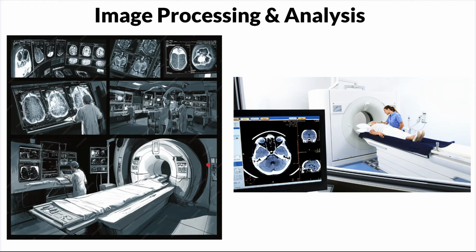Once you take the scan and you give it to the radiologist or neurologist for them to read, if the scan that you took is not all that clear, remember they are going to struggle to interpret the results. And yesterday we learned that machine learning and deep learning are able to extract certain features that we human beings will find difficult to see. But although they are able to do that, we still have to process.